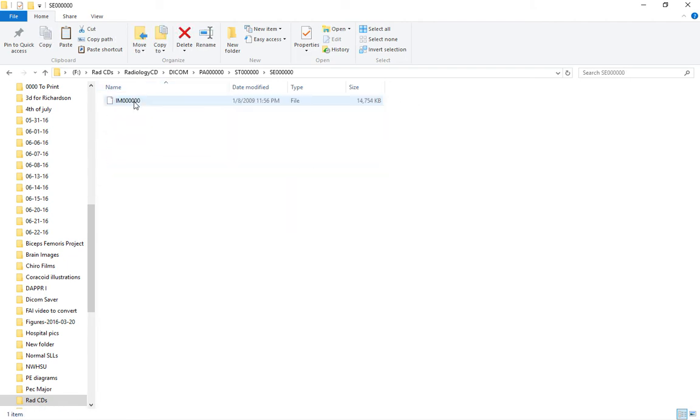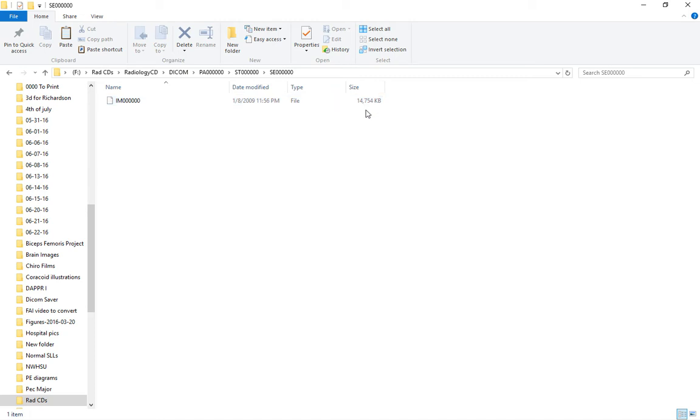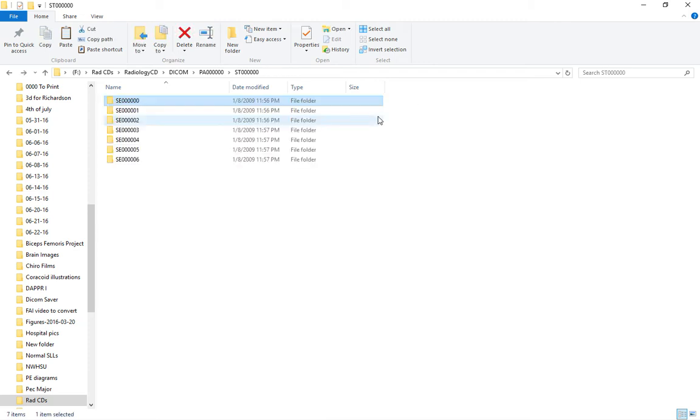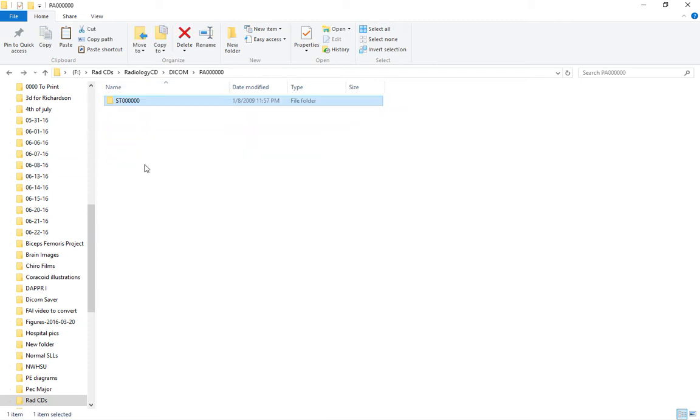We know these are DICOM files because of their large file sizes. DICOM files are typically 5 to 30 megabytes in size, and these are all the appropriate file sizes. I know that these are the studies because I checked ahead of time, and they're in the DICOM folder, which helps.